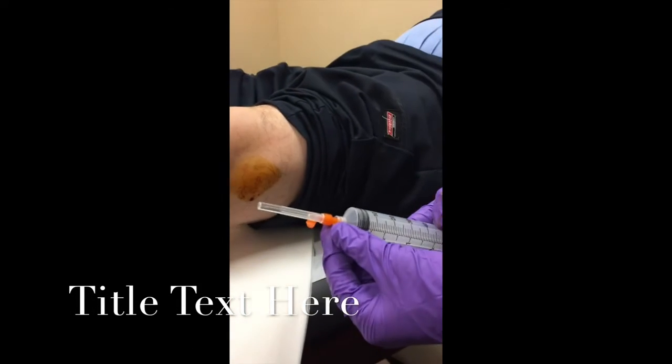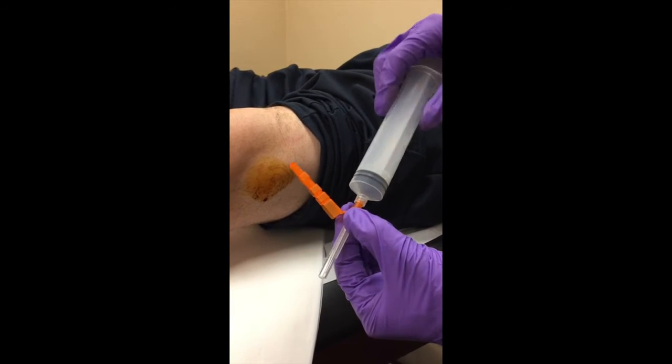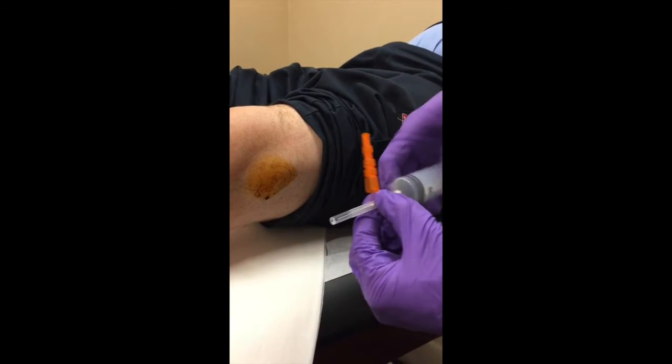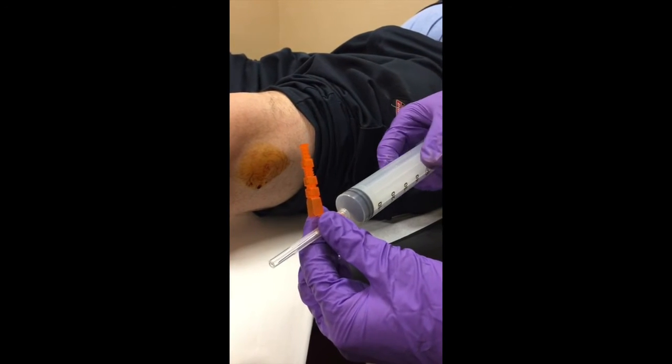A little technical pearl: make sure the orange safety cap is on enough that you can get it on and off pretty easily, but also make sure the actual needle itself is screwed on quite hard — you want to be able to get the safety cap off without the needle flying off.